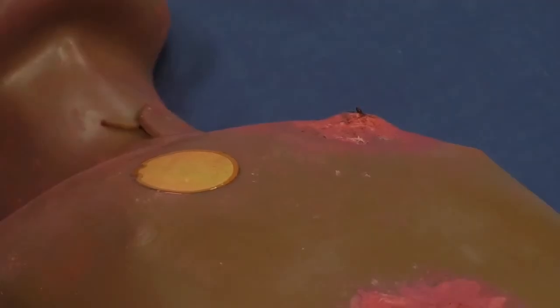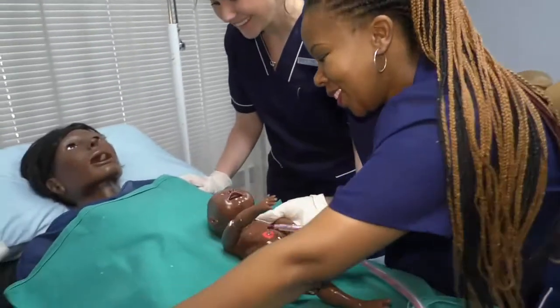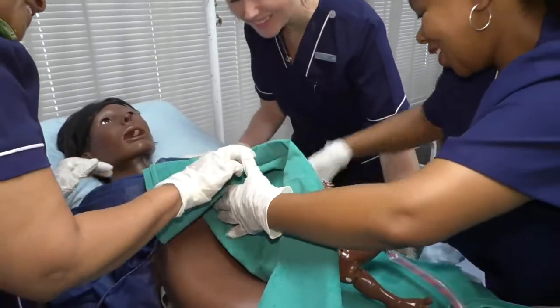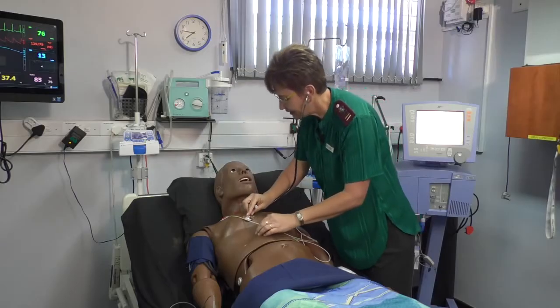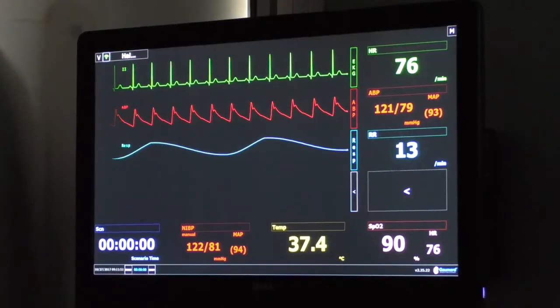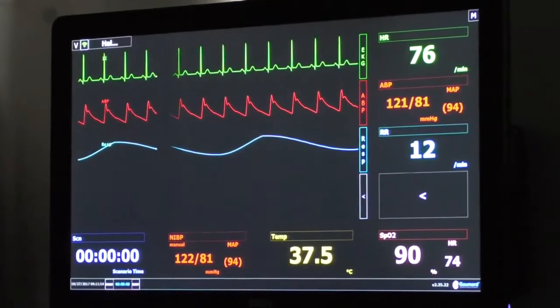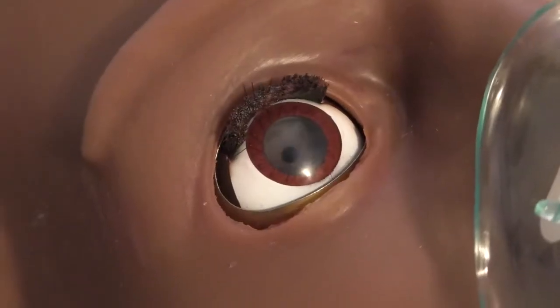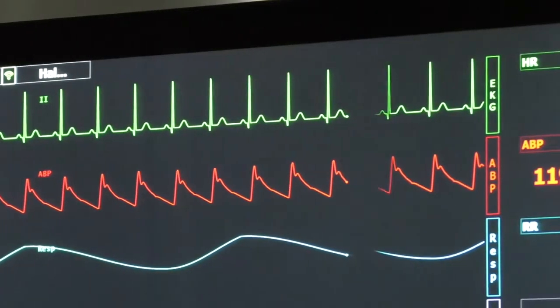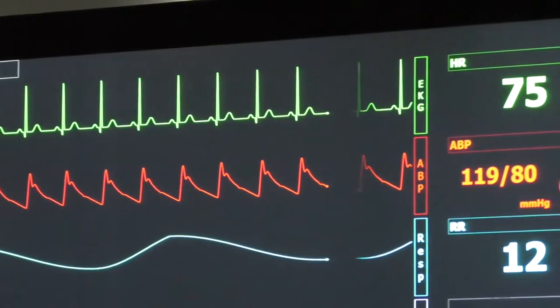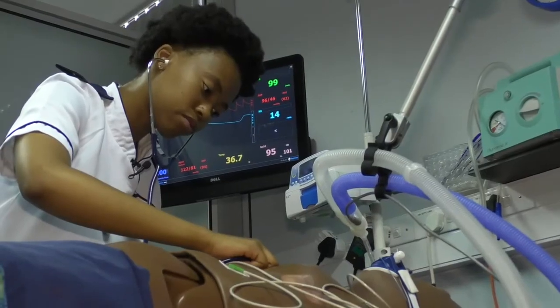All high fidelity simulators — namely the adult, pediatric, and birthing mom simulators — are equipped with software that allows for the replication of physiological features such as a heartbeat, breathing sounds, pupil reaction to light, and skin discoloration. Vital signs and other necessary information are displayed on a monitor at the patient's bedside.